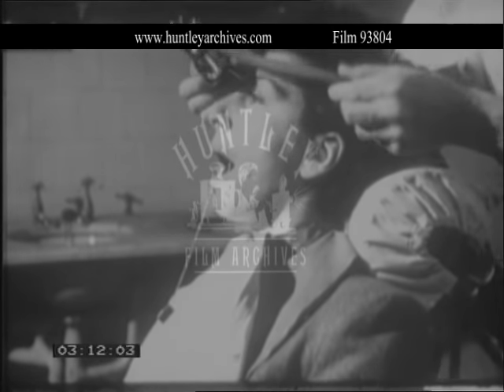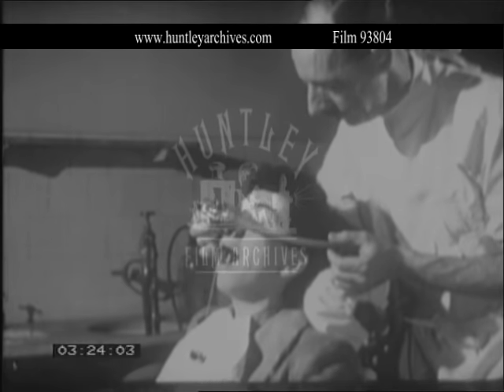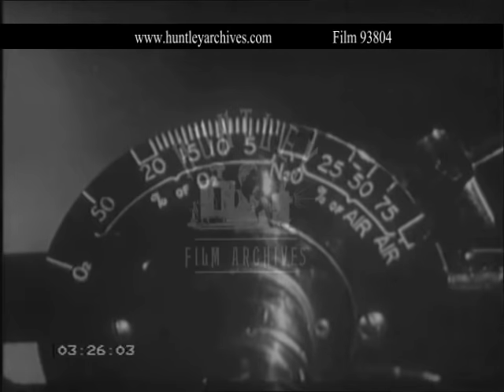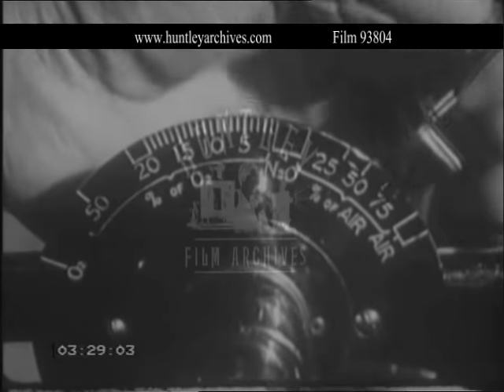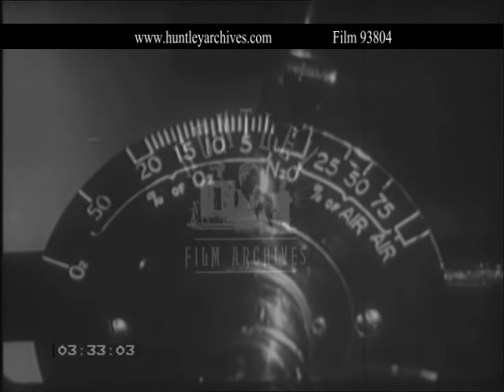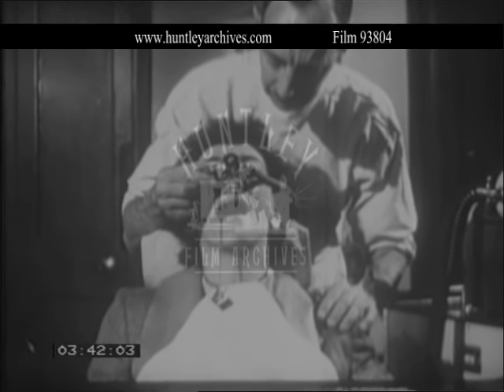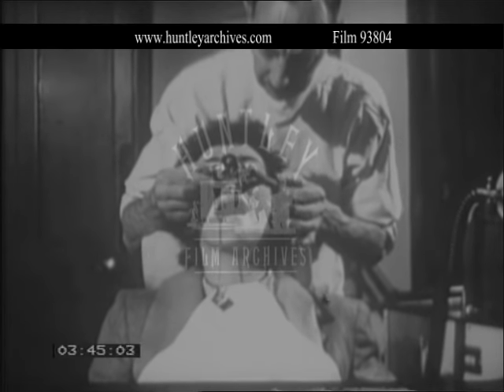Hold the nose piece about one inch away from the nose. Talk to her from the start of the induction and encourage and praise her cooperation. Persuade your patient into nasal breathing and do not attempt to force the gas in under pressure. Nitrous oxide with no added oxygen is used during the induction, otherwise it will be unduly prolonged and the patient will get worried that nothing much is happening. Urge the patient to relax, to drop the shoulders. Explain that shortly a muzzy feeling will be noticed — this is the first sign of loss of consciousness.